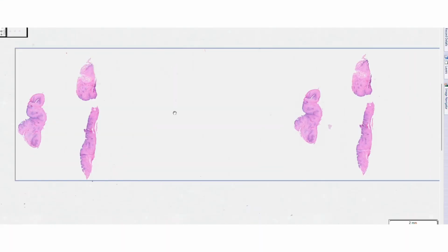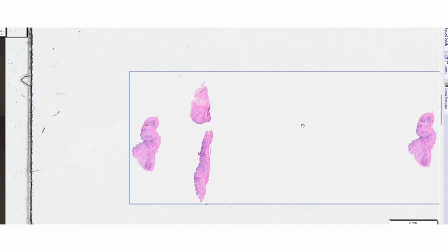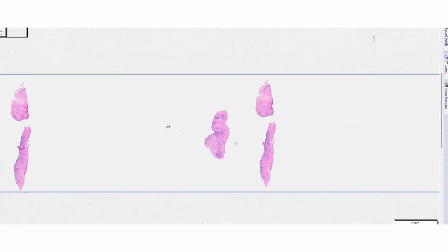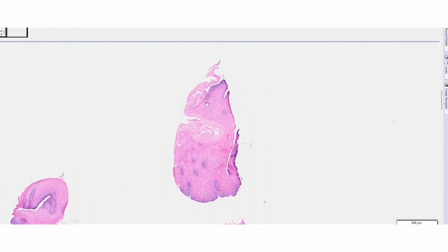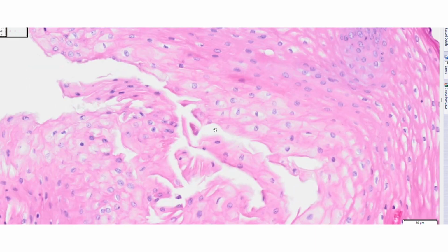This is the distal esophagus of the same patient, and I would like to show you, first of all, on low magnification, you still see an abnormal architecture, especially here with this tissue layer forming these coves with papillary fronds within. And that I just wanted to show you.